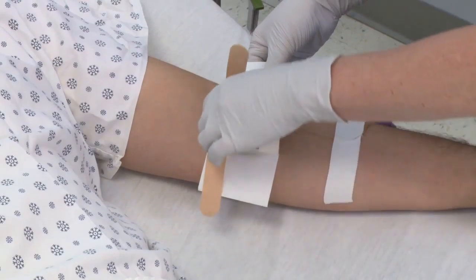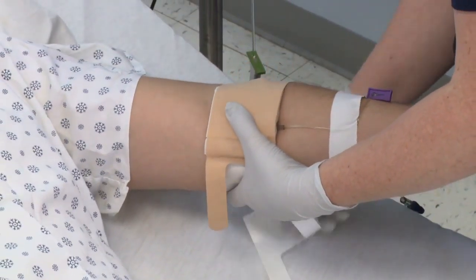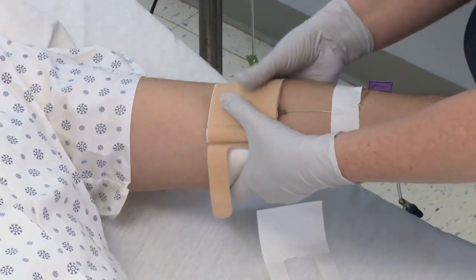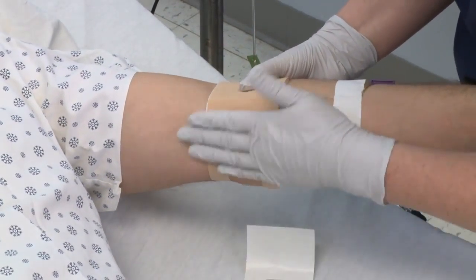To apply the Dale IV Armor, pull back the liner and press it against the skin in one motion to adhere it to the patient. Repeat this procedure on the other side. Do not stretch to apply.